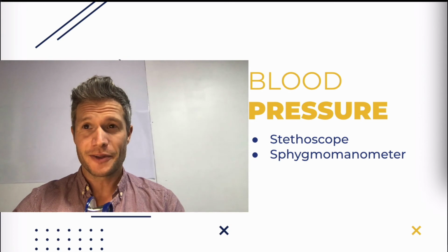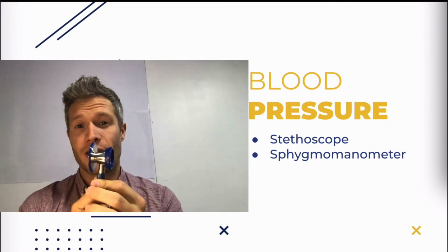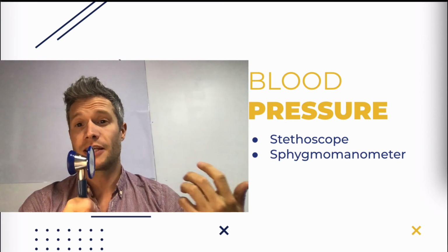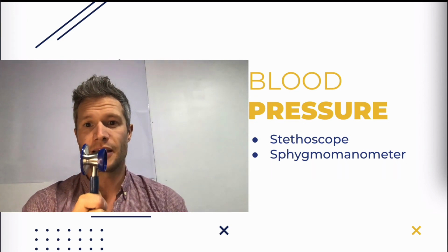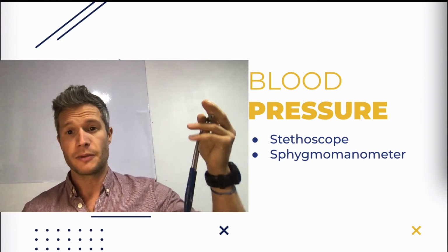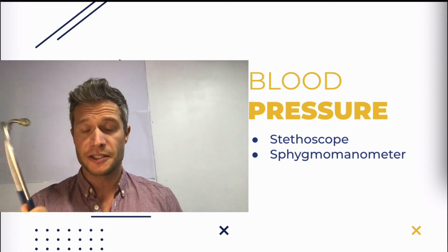One of the important things to remember while you're first starting out with a stethoscope is that there's actually an on and off, okay? So you take the drum and you essentially rotate it. That could be on or off, and I'll show you how to check for this after. And then you rotate it back again. I didn't move this, okay? So that's that end. That's the part that's going to go on the person to be able to auscultate or listen to them. And then the other end is the earpieces.